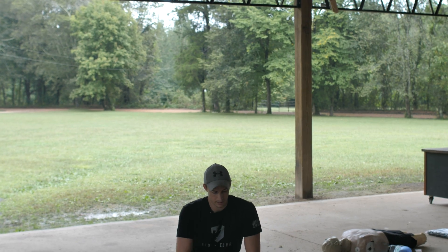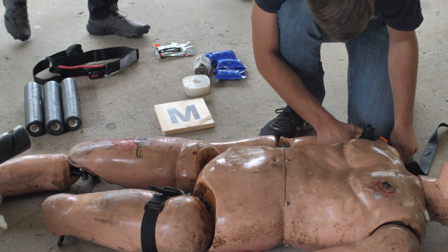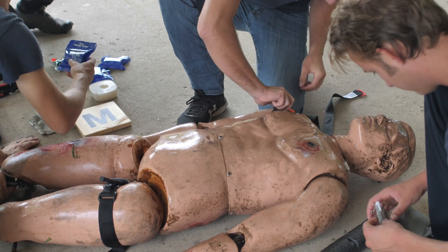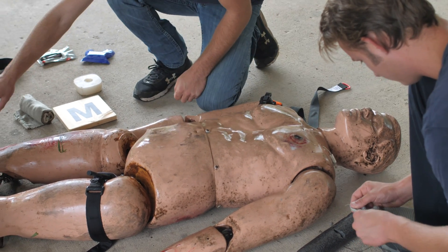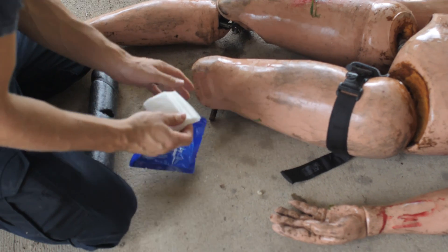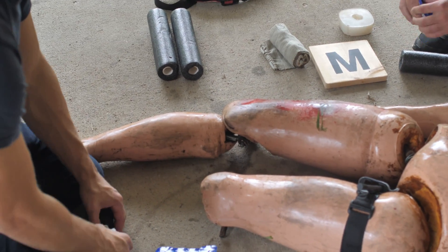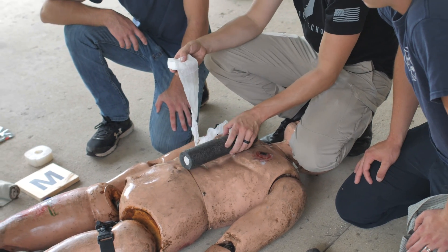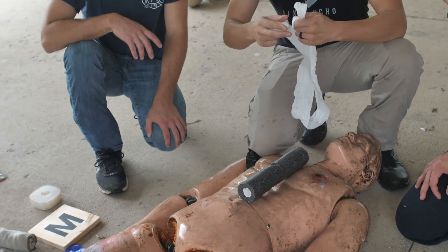If there's internal bleeding here, there's not much we can do about it. Most of you have already done wound packing, so we're not going to spend a lot of time on this — just make sure you fill that entire void, that entire area. That PVC is representing a bone; you've got the tissue around it. We're going to pack that tissue down to the bone and then wrap around it with a pressure dressing to hold it in place. We've got wound packing gauze, Z-folded like this. We're going to take a little bit and make a small ball at the end first.